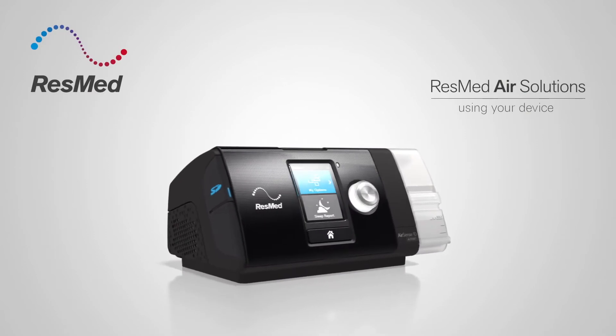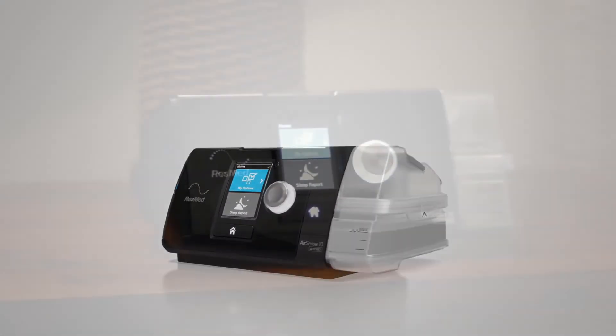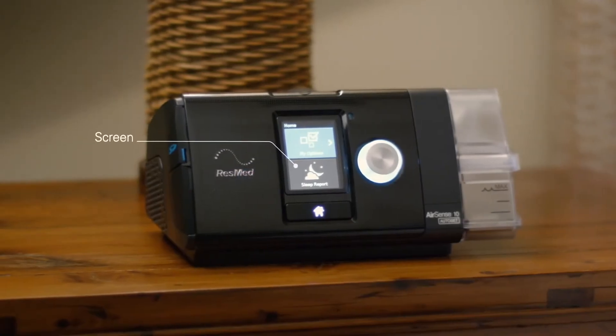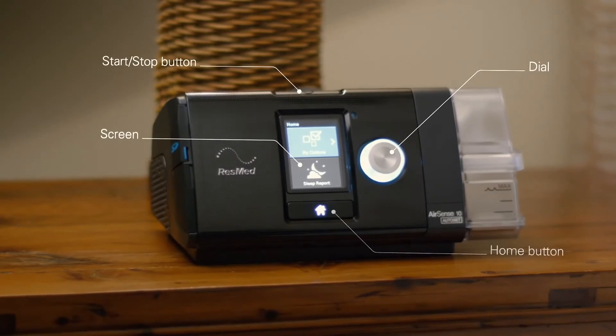With your device set up, it's now time to find out how it works. You'll see it has a display screen, a navigation dial, a start-stop button, and a home button.